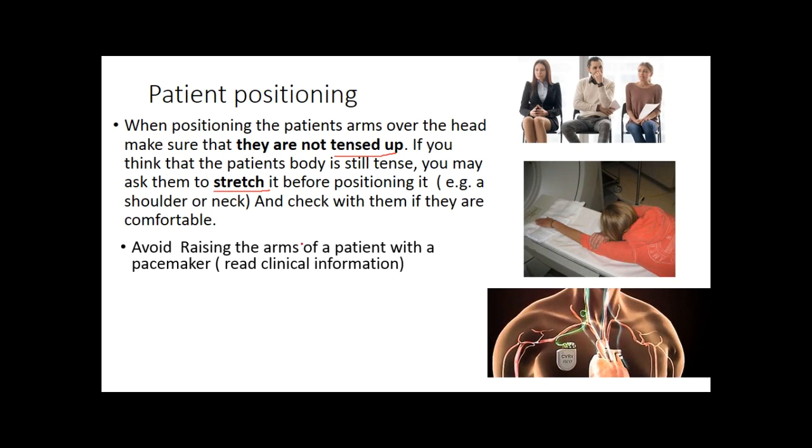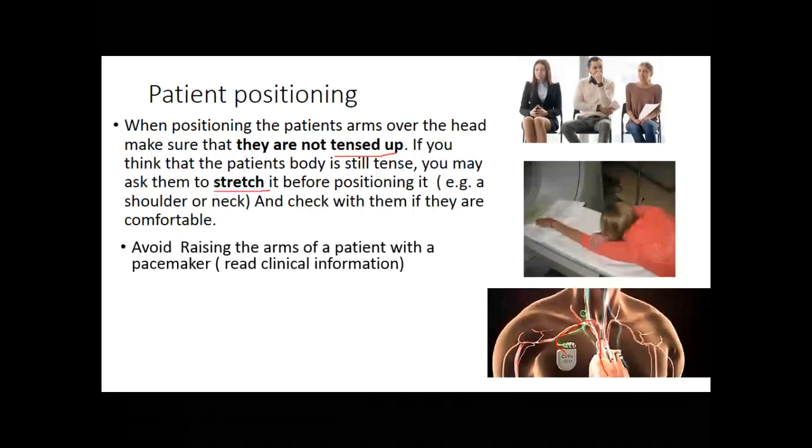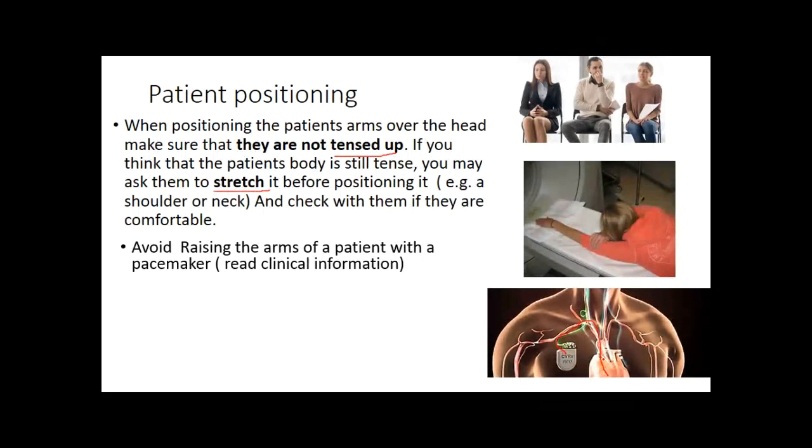Avoid raising the arms of the patient with a pacemaker, okay? Especially if they have a new pacemaker put in within a month. So when you are raising their arm, the leads might change position, and it will cause fluctuation in heart rhythm.